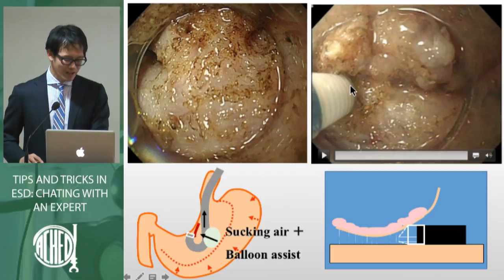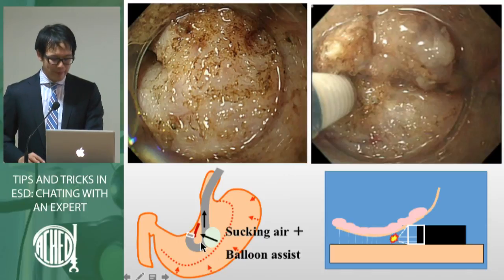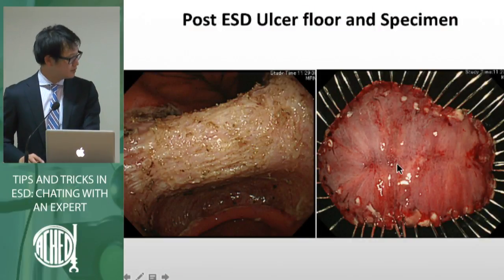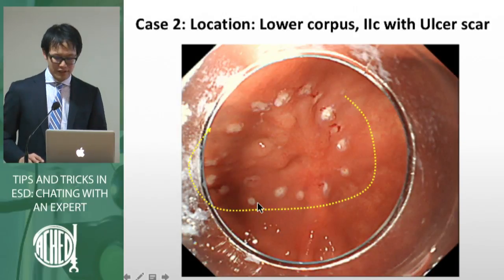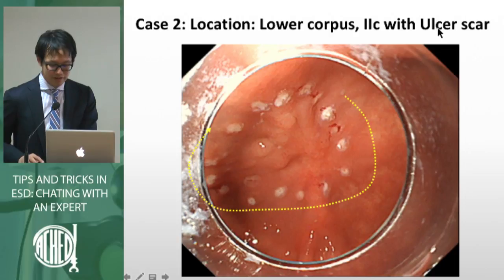So for the ESD procedure, it is very important to approach and cross the region. So finally, we completely resected it, even with much severe fibrosis. So this is a second case. This is also the lower corpus. The location is the lower corpus, with ulcer scars.